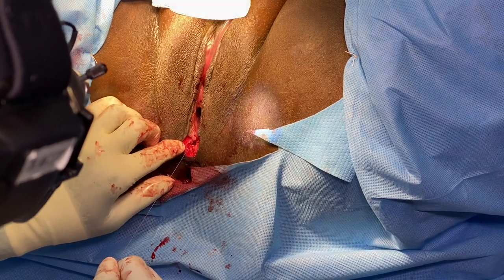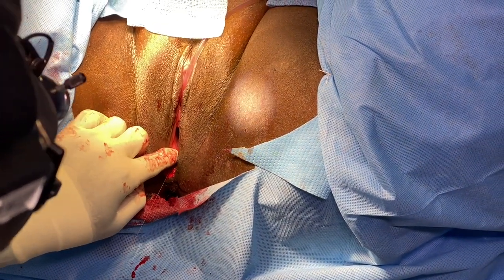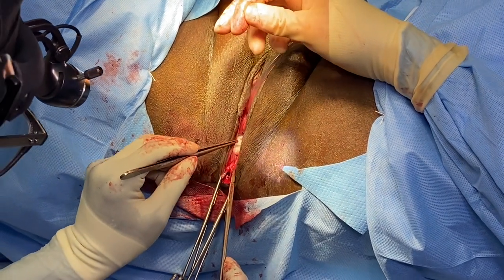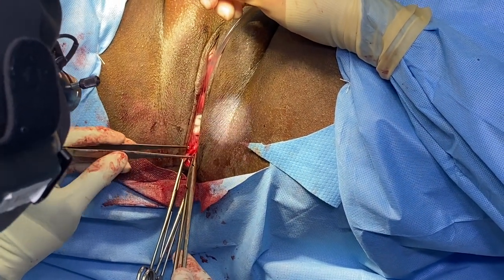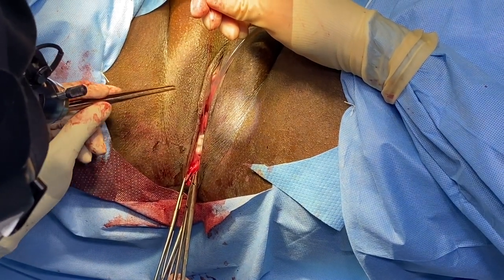Now we have to repair the perineum. That takes a toll as well. We want to build up the perineal body. This is the perineum. We'll bring you back in. Okay, now we brought the hymenal ring back together. That's the hymenal ring here. We brought that back together. Now we want to bring the ends of the labia minora back together. Here's the labia majora. Here's the labia minora.